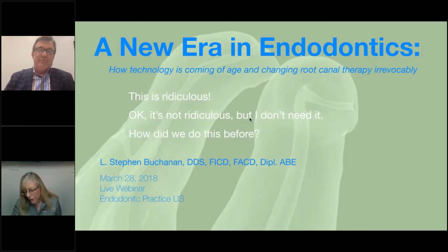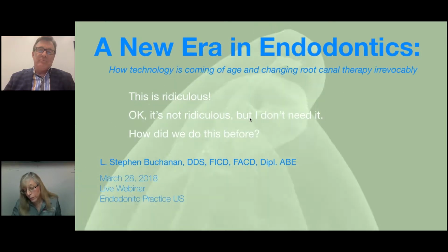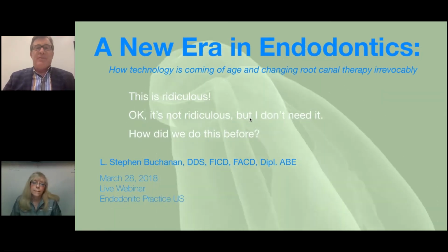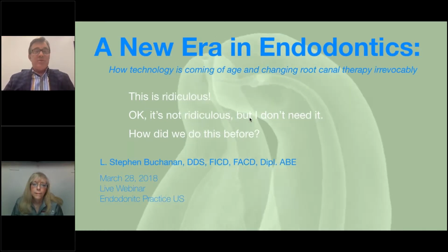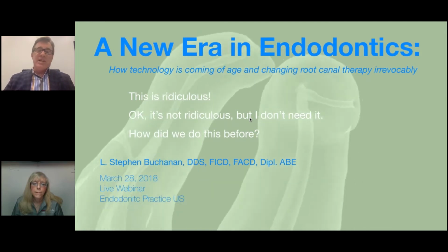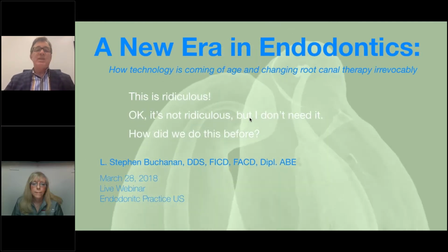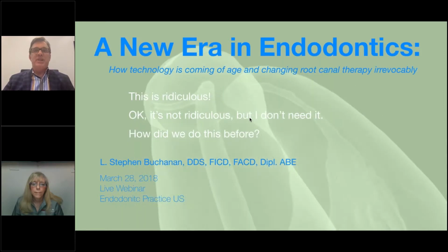Okay, second question. Do you find guided surgery necessary for all endodontic procedures or just specific types of cases? No, if it's got a pulp chamber, you only have to drill 2 millimeters to find it. So unless it's a case where I'm trying to do absolute minimally invasive, I'm going to have a separate opening into the pulp chamber for each of the canals. I'm still experimenting with it and finding out what the limits are and where it's practical to use, but obviously calcifications are the most obvious, the greatest benefit of this technology.